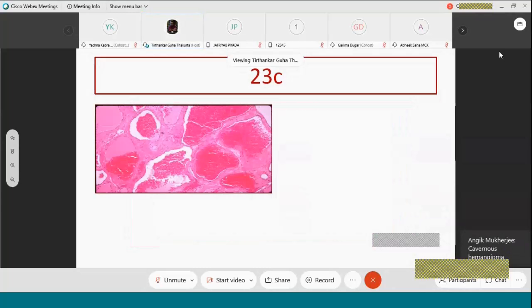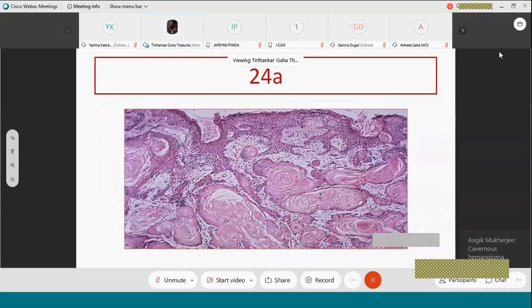What is this tumor? This is squamous cell carcinoma. Now see, not because of the keratin pearl. You see, this is the epidermis, the upper dark area. The pale area is dermis. The keratin pearls are secreted by malignant cells. That means malignant cells must have come down from the epidermis to the dermis, because dermis does not contain squamous cells. It is this invasive nature that makes it a carcinoma.